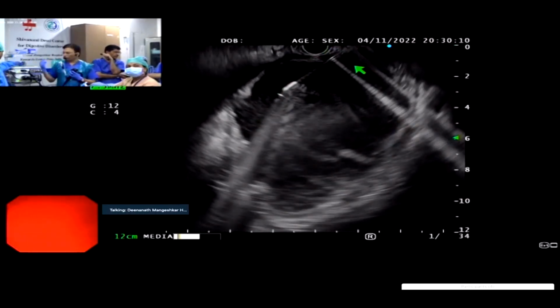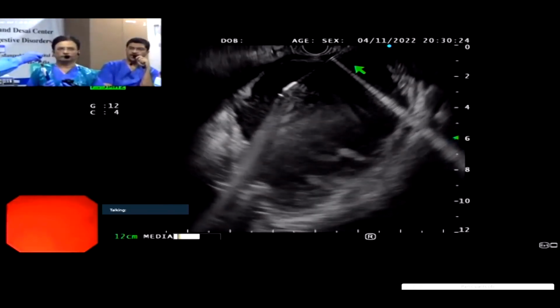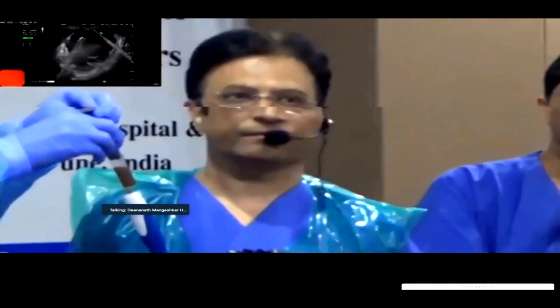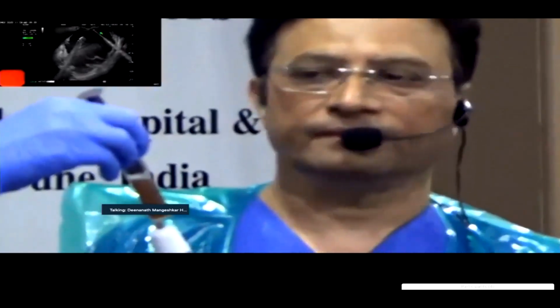So I am going to aspirate the fluid. Can you aspirate the fluid? Can you focus the camera over here, over the needle? This looks like turbid and cloudy, brownish fluid. So it definitely looks like infected fluid. That is the reason he is having fever. Okay.